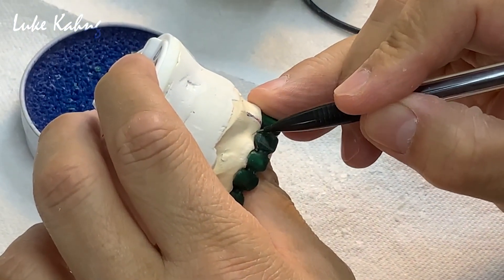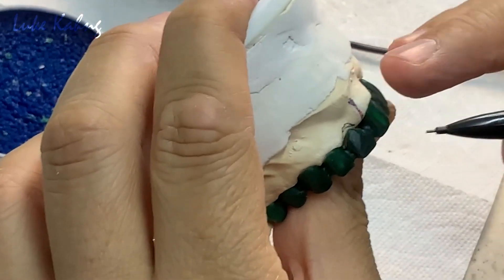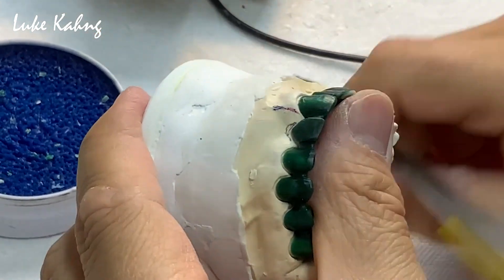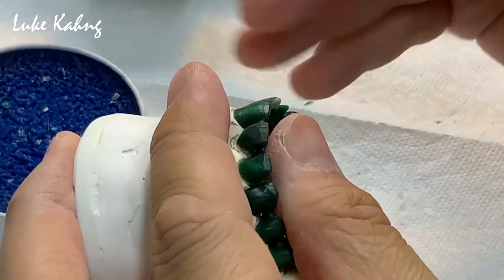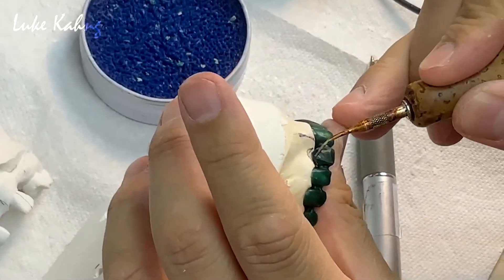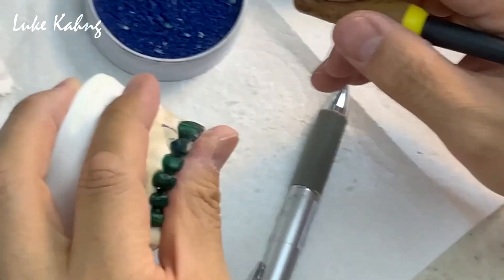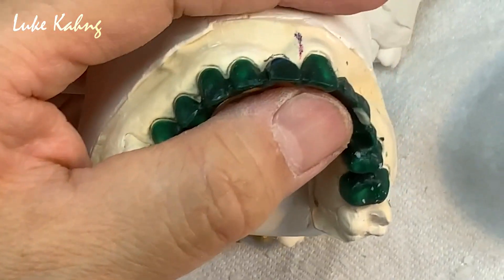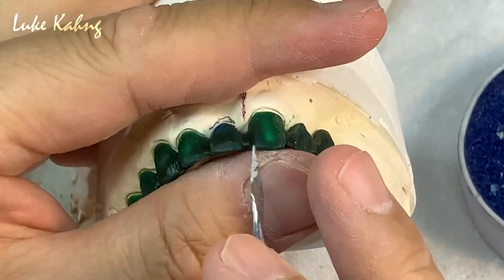Drawing the line — this is a good shot. Drawing the line between 8 and 9. Same contour you have to fabricate. You see the side view — this is a metal ceramic, so I have to make a little height of contour in between here.